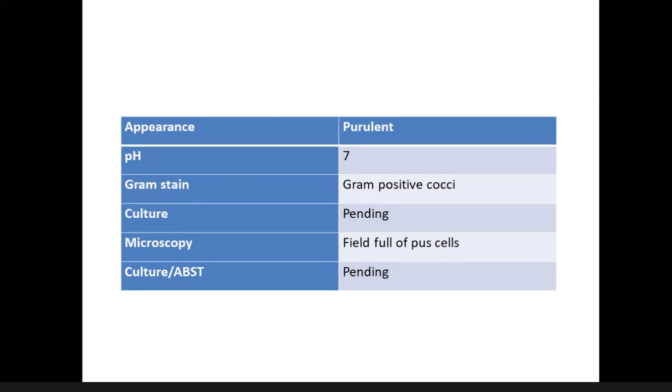I think I showed those X-rays at the beginning. You draw a line along the hilum and then a transverse line as well. I don't have an X-ray like that. If it is above the transverse line, it is the upper lobe; if it is between the transverse line and the oblique line, it is the middle lobe; and if it is below the oblique line, it is the lower lobe.